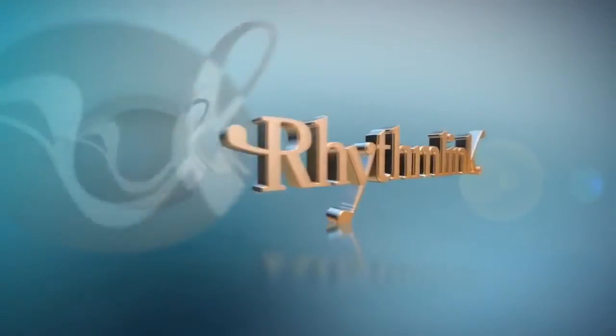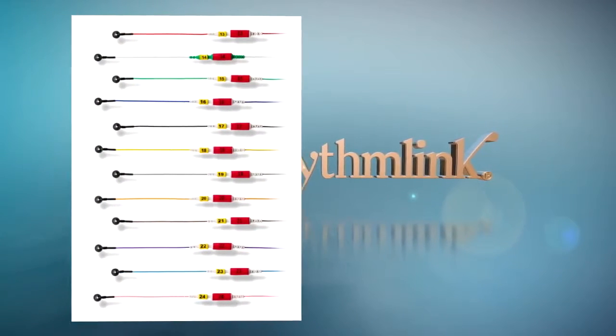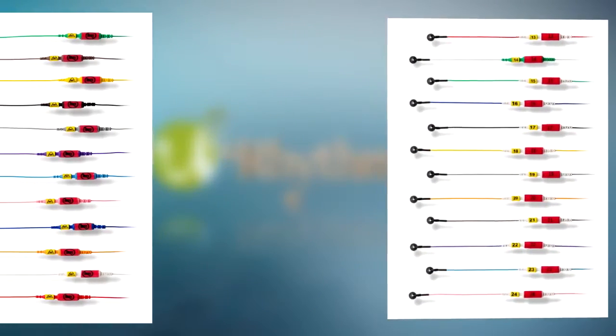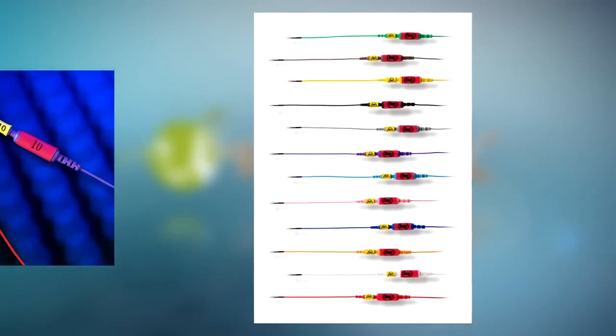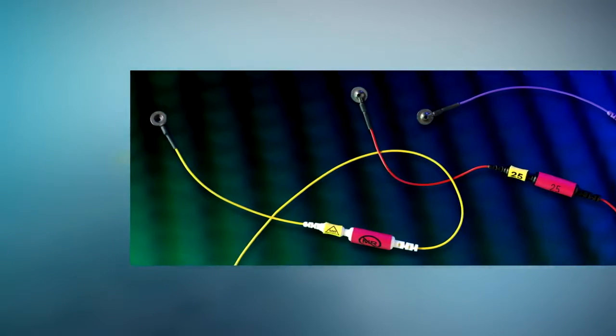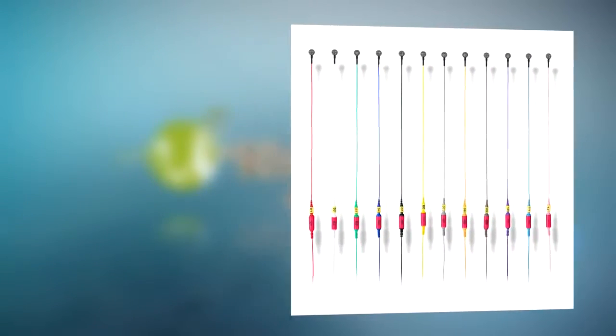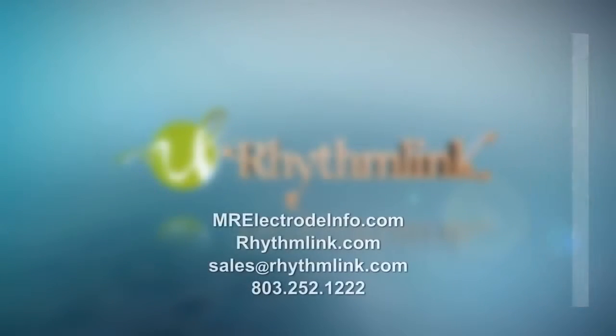RhythmLink offers the largest variety of MR-Clear disposable EEG products for 1.5 and 3T MRI. Products can be mixed and matched on the patient to maximize efficiency. RhythmLink offers MR Conditional cups, EEG webs, press-ons, and other accessories.